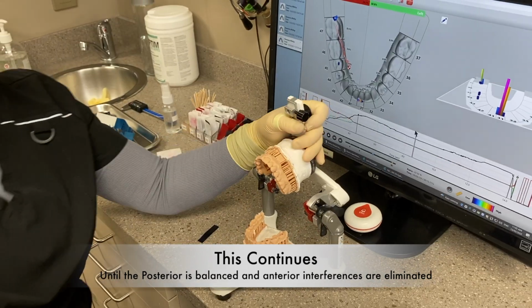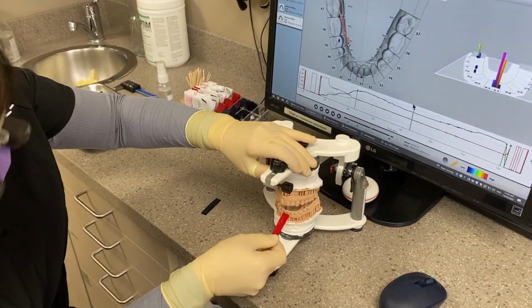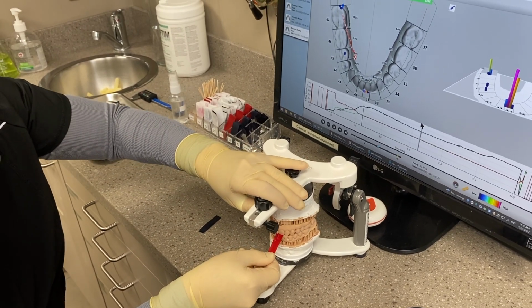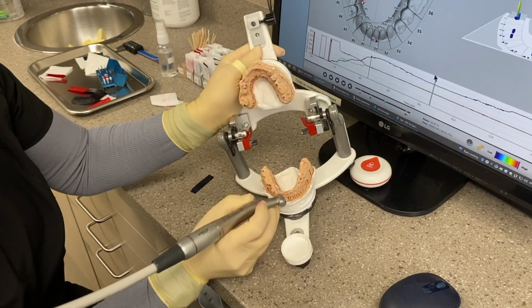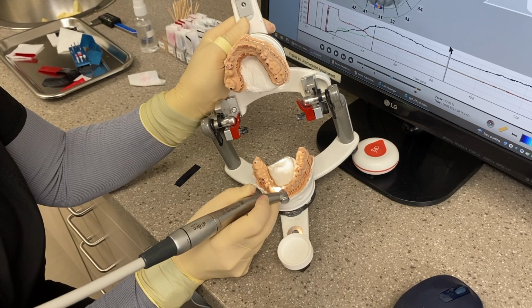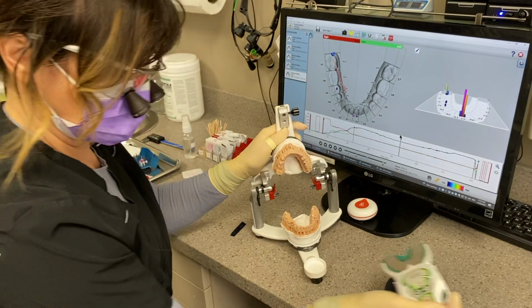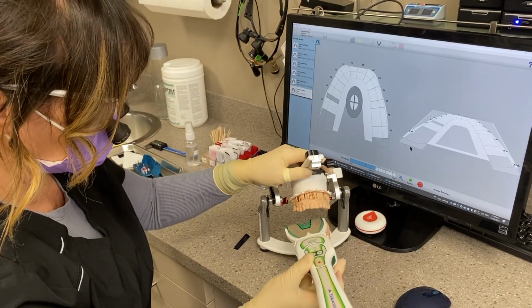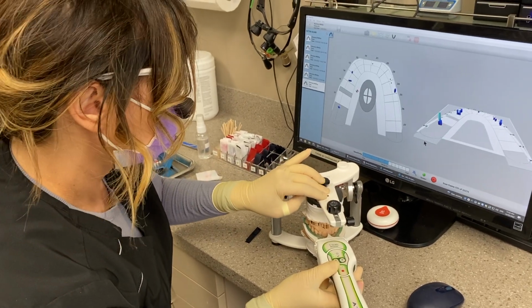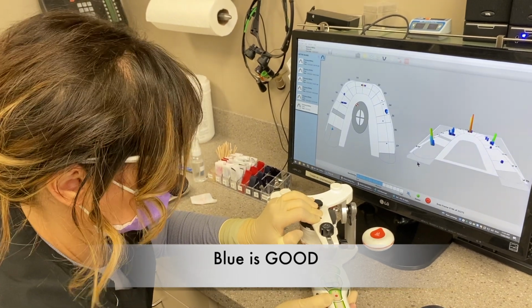And then we're going to do the front teeth. We do not want her touching on the front just yet. 3-1. I'm going to adjust the lower just because it's a little ragged looking. Alright, let's see where we go now.